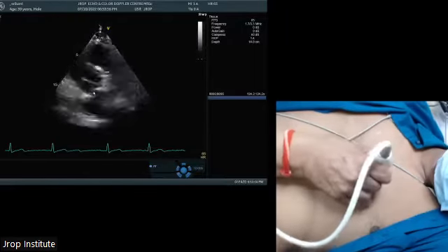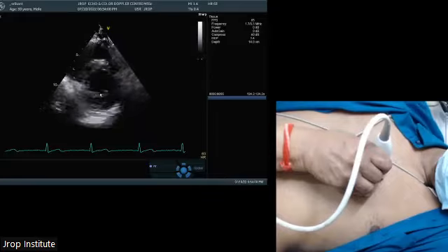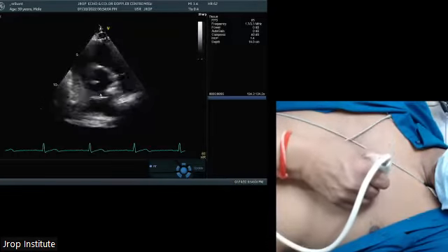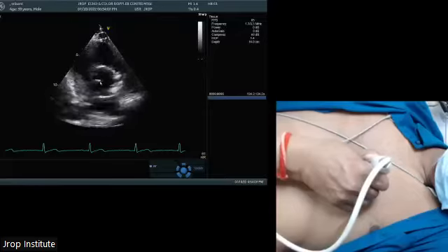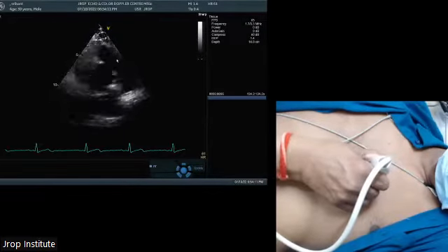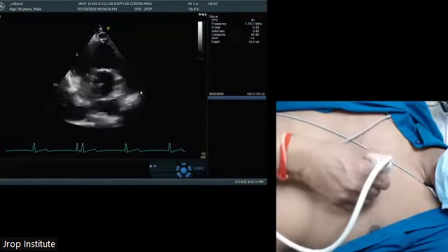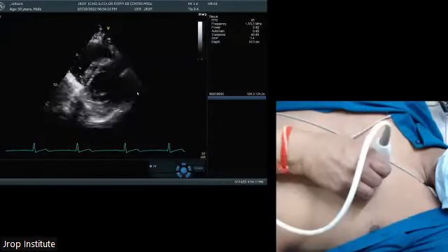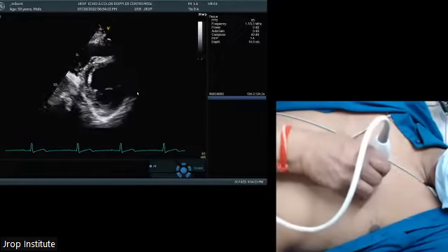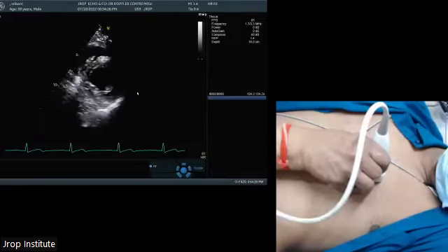I'm going from the parasternal window, rotate 90 degrees, mitral valve. My arrow is on the mitral valve right now. Let the footprint look towards the right shoulder, aorta. So this is the aorta in the center, RA, RV, proximal RVOT, distal RVOT, the pulmonic artery will bifurcate to right and left. Then my footprint starts looking towards the left hip from the aorta: first papillary muscles, mitral valve, then papillary muscle, and finally the apex.